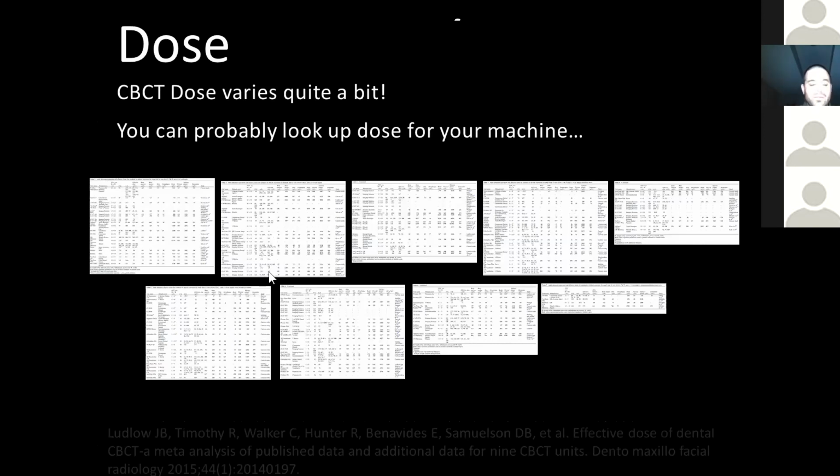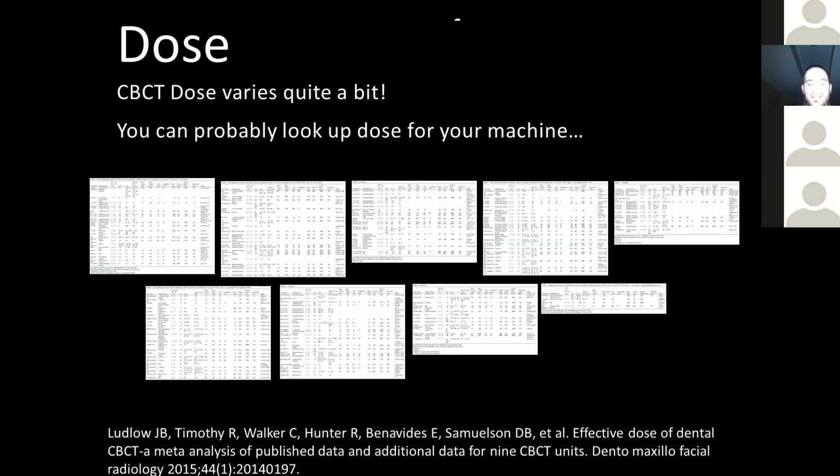And this might be useful if you're deciding, hey, if I choose the 20-second scan versus the 30-second scan, how much dose difference does that make? You might feel surprised by a jump in dose, or you might feel comforted by a marginal jump in dose. And anybody can email me if they have interesting questions about that.